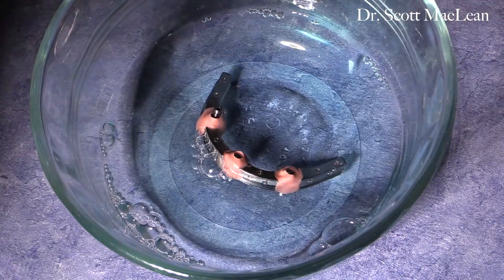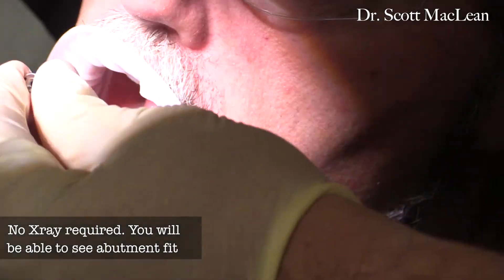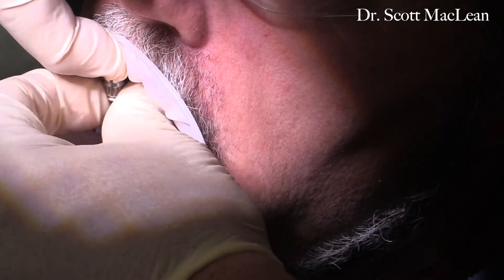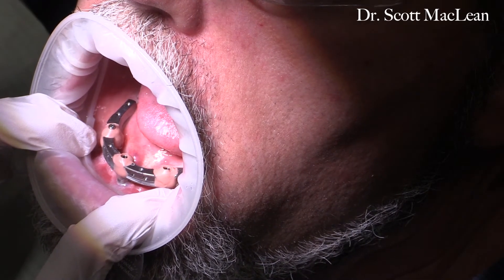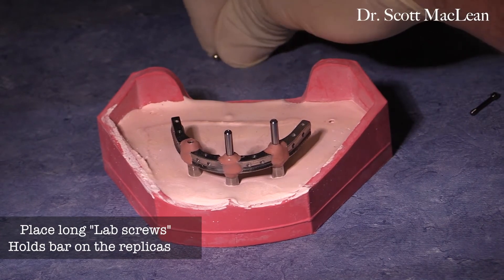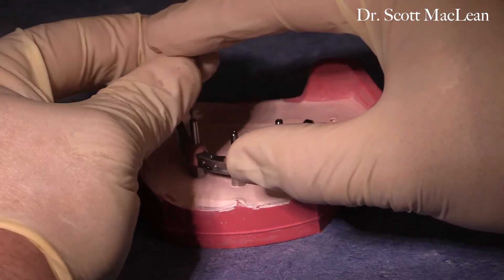We'll use a sterile Pyrex bowl with some chlorhexidine to disinfect the bar prior to placing it in the patient's mouth. The single screw is in position as we carry this to the patient's mouth, placing it down on top of the implants. You don't have to take an X-ray at this point because the implants sit about four to five millimeters above the tissue, so you can easily visualize what's going on. In yellow you can see the screw is down, and the red arrows show it is passively fitting on top of the implants. The single screw test confirms the bar is sitting passively, which is very important at this stage.